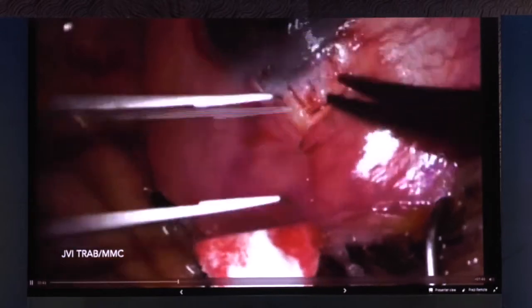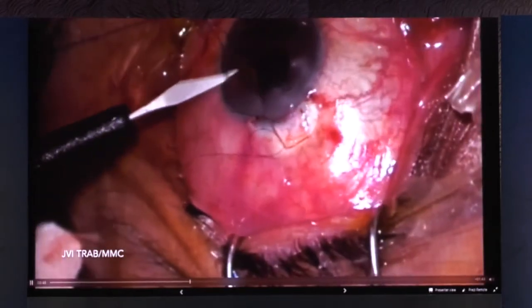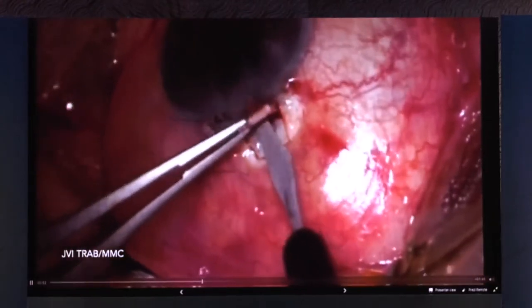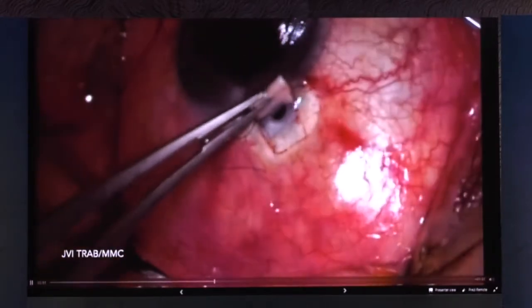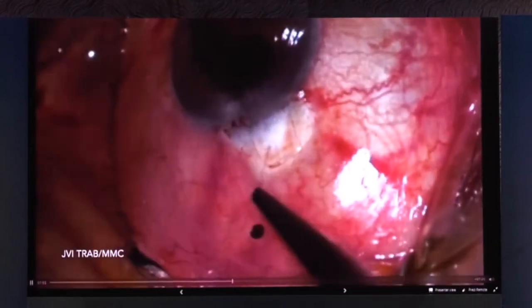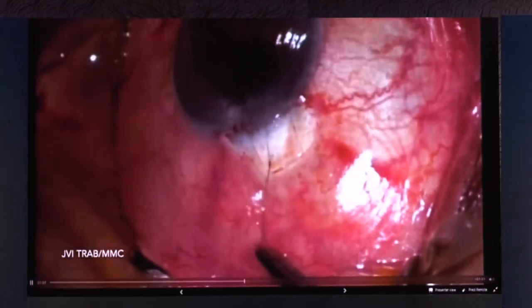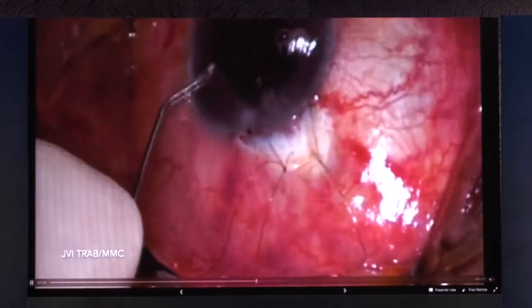In cases where I do not want sudden decompression of the eye, I want to maintain the anterior chamber, so I put a pre-placed suture, and then I put a side port, and then I do a sclerostomy with a punch, and I snip a small aspect of the iris for iridectomy, and then while ensuring that the anterior chamber is formed, I do two adjustable knots. I do adjustable knots so that I can test the aqueous egress from the flap on the table itself, and then I can adjust the knot.